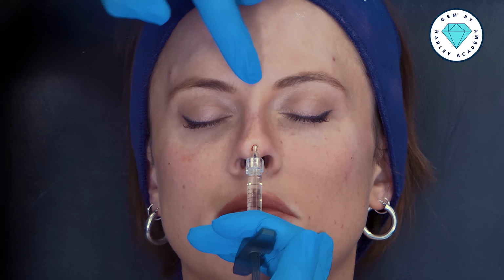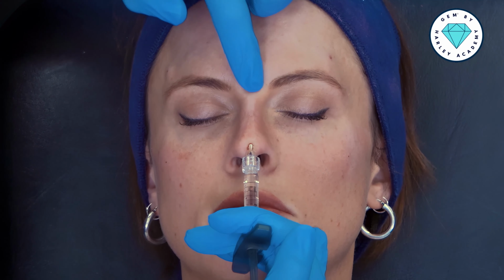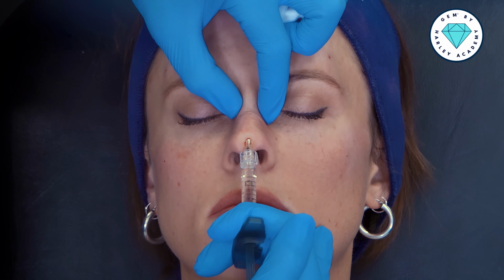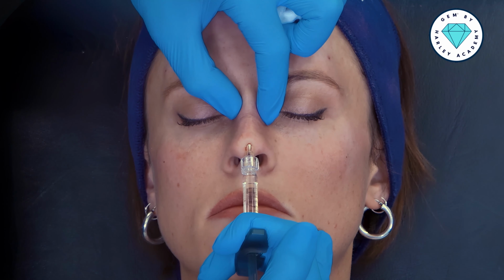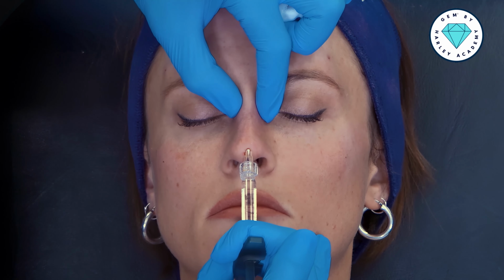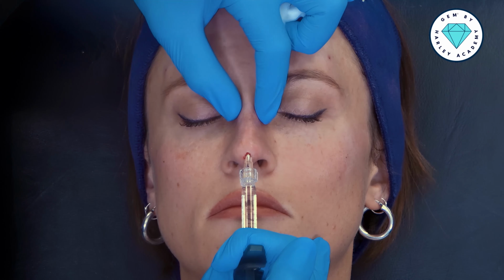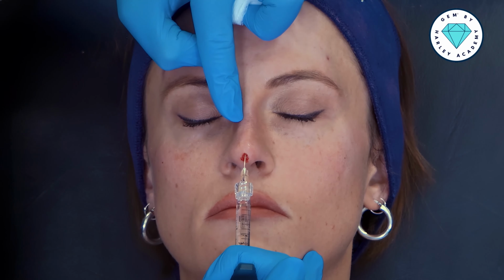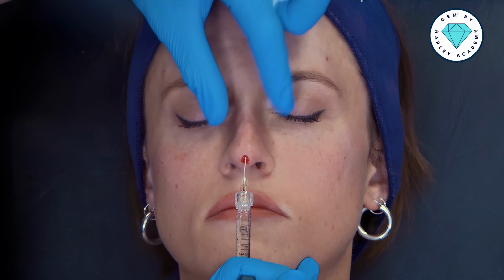So I'm in layer 4 of the nose, all the way up to the radix of the nose, and I'm slowly injecting now. And then I'm going to stop injecting at the dorsal hump and continue injecting again.